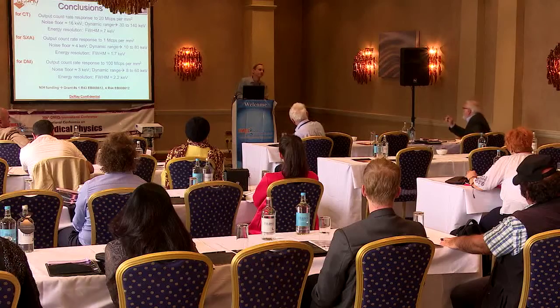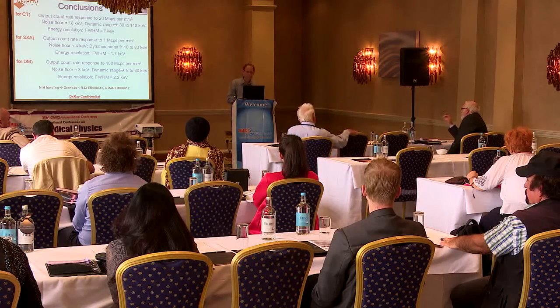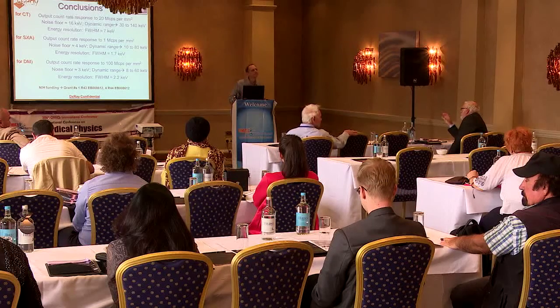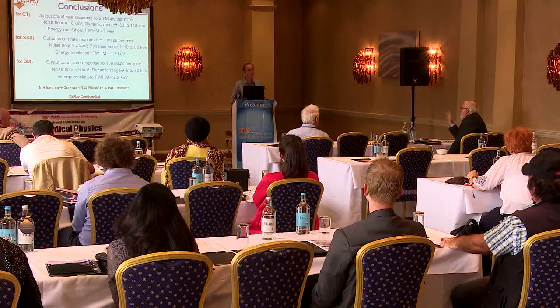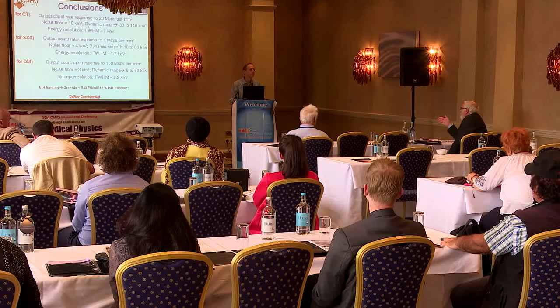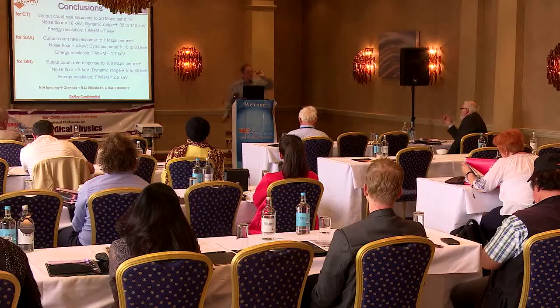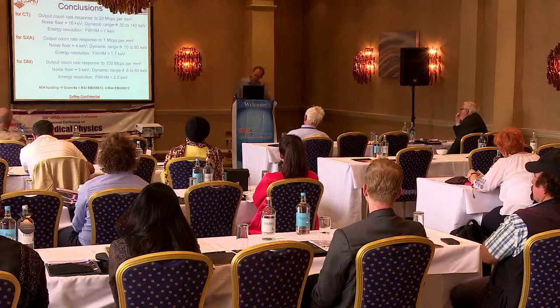When you started talking about the spectral analysis detectors in connection with the bone absorption work, you said that this reduced the dose, and I wasn't quite sure why, because presumably if you sort the image into energy spectra, your counts are very much lower? That's another excellent question.